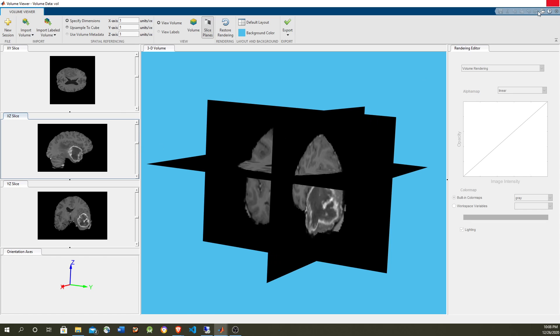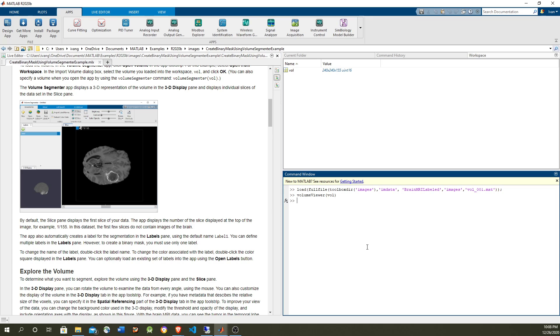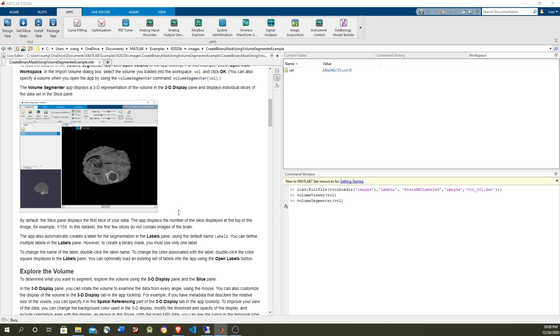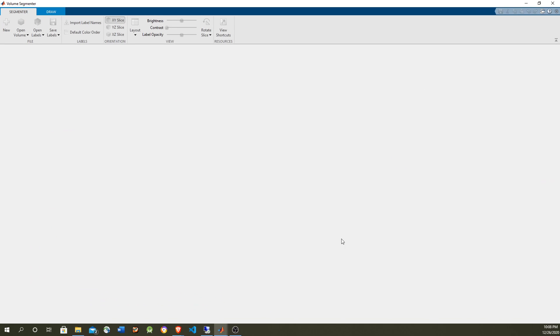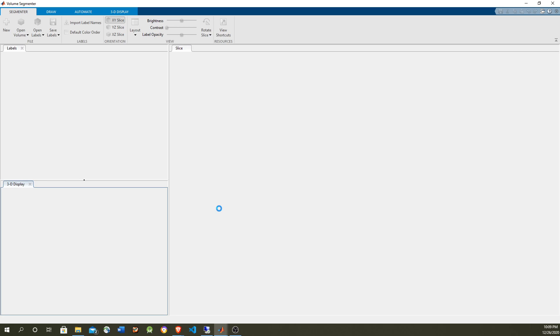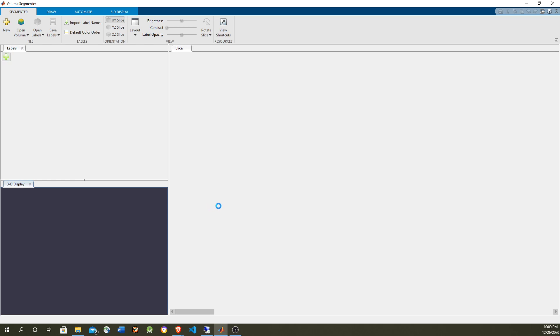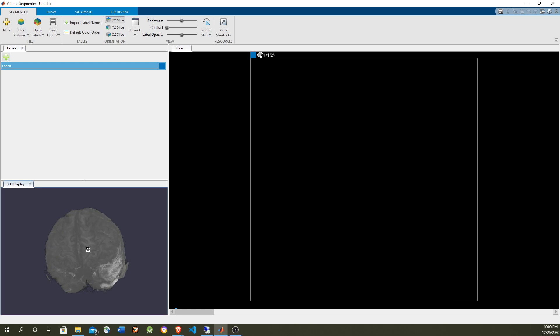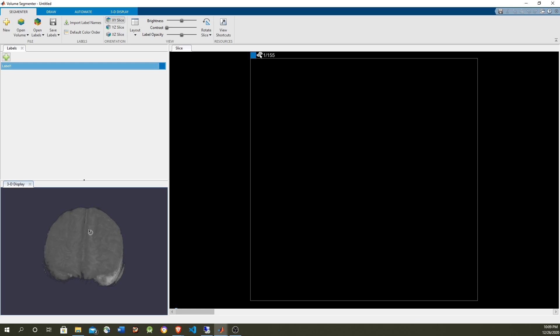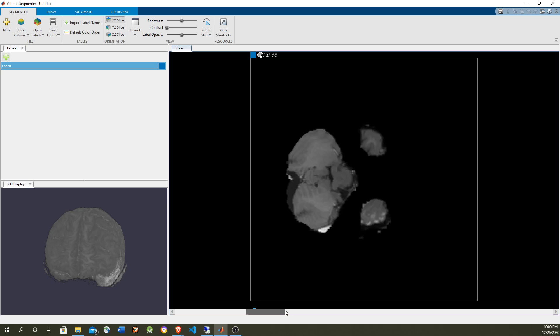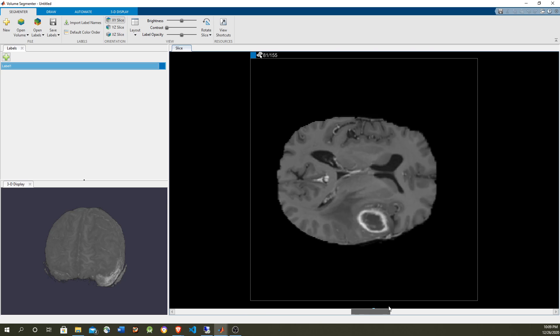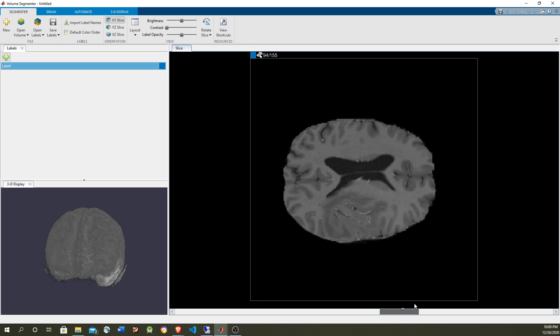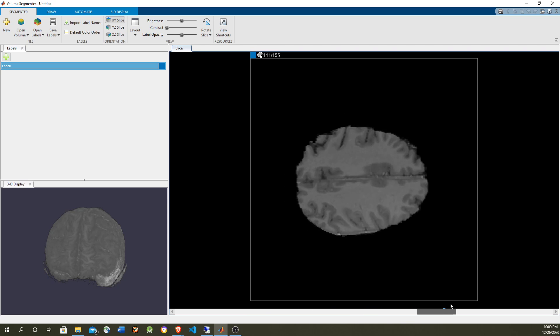So for that we're going to use the volume segmenter. The volume segmenter looks similar, but the 3-dimensional image is here. You can rotate and zoom with the same bottom scrolling with the mouse, moving with the mouse.